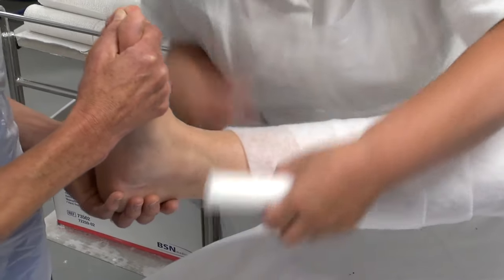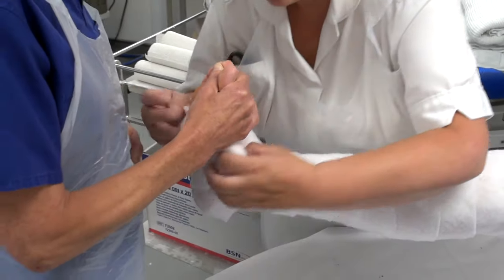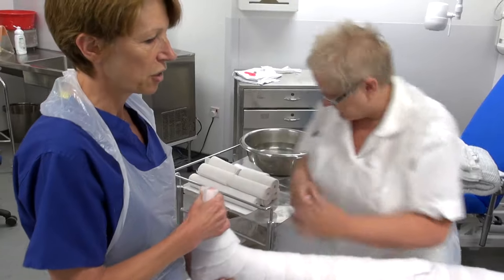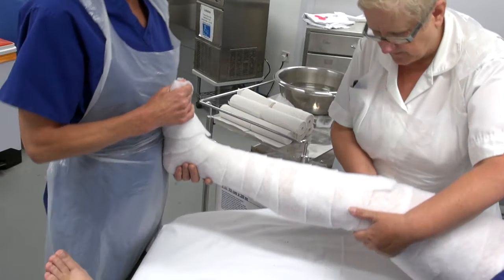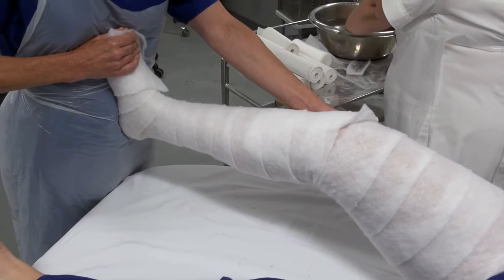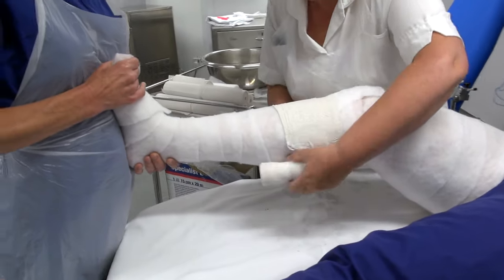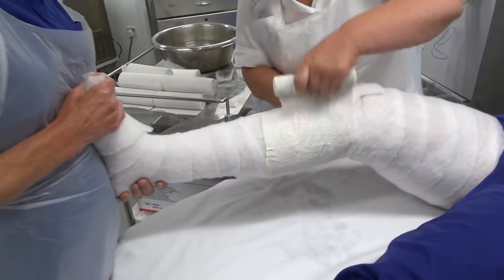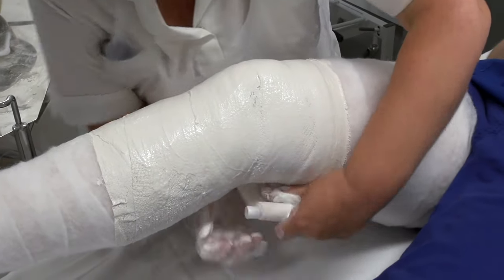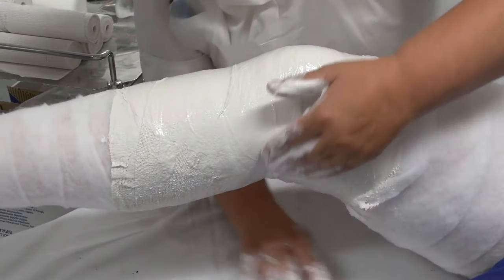This plaster would be put on for a fracture to the tibia, fibula, or tibia and fibula. For the purpose of demonstration, we're going to pretend it's a tibial plateau fracture, so we need to start plastering at the fracture site — Pam will start around the knee area. We need to keep the knee in a slight flex, a natural flex of about 15 to 20 degrees, with the foot at 90 degrees, and no inversion or eversion of the ankle. Pam's applying her first plaster over the knee area, which would be our fracture site.